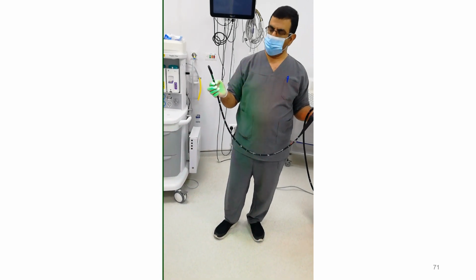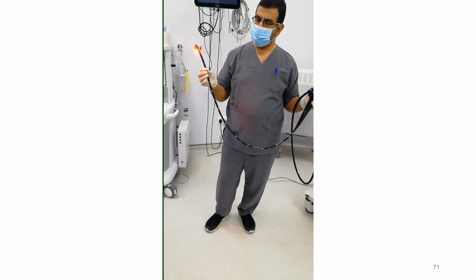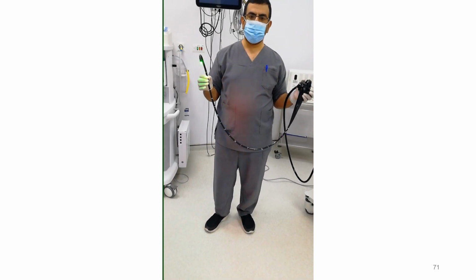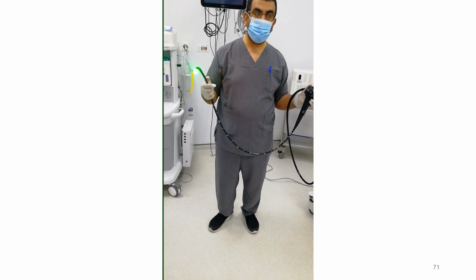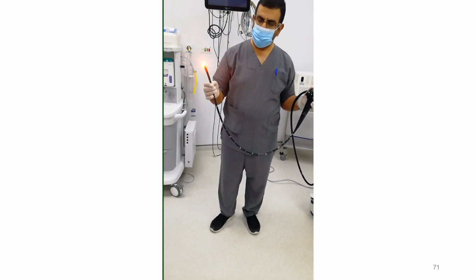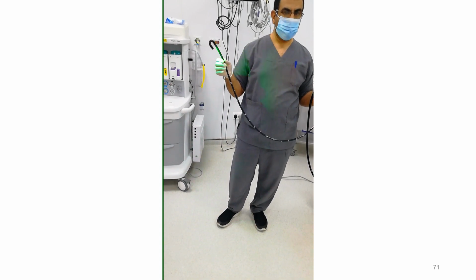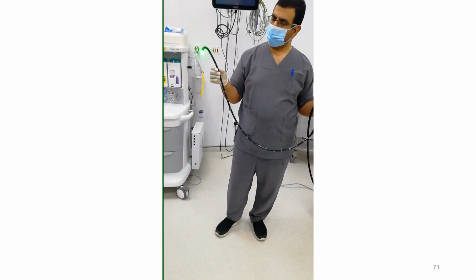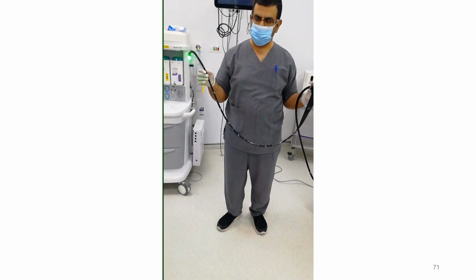في نقطة مهمة قوي إنك لما بتيجي تحقن الفندس فيرسس بتحقنه، أحيانا المناظير بتختلف على حسب السوق بتاعها وعلى حسب الصناعة بتاعتها وعلى حسب المنظار قديم أو جديد. لو المنظار جديد هتلاقي إنه بيعمل ريفليكشن حلو معاك كده خلاص. أحيانا المناظير القديمة هتلاقي الريفليكشن بتاعها كده، فلما بتحقن الفندس فيرسس هتلاقي في صعوبة، خلاص اتفقنا.